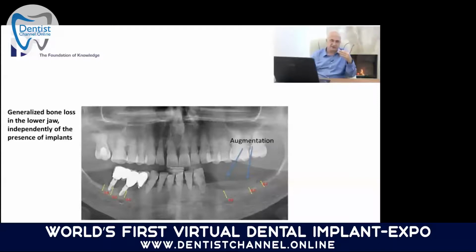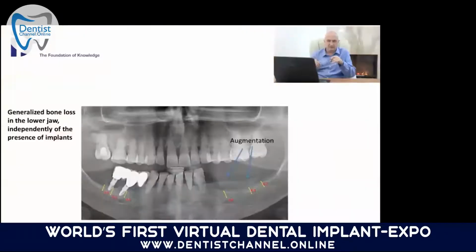And the osteonal remodeling kind of creates instability around the implants inside the bone. And as soon as the remodeling starts, we should be ready with our work, because then the bridge is needed as a device to splint the implants. So we are selling, of course, immediate loading to the patient, but what we are doing actually is immediate splinting. Immediate means within 3 days.